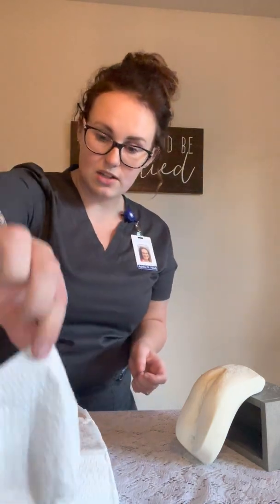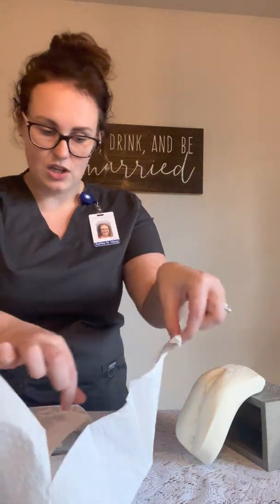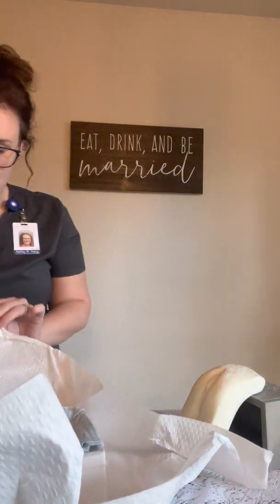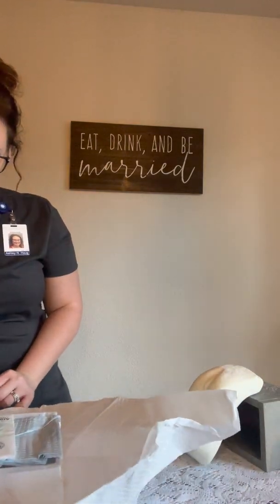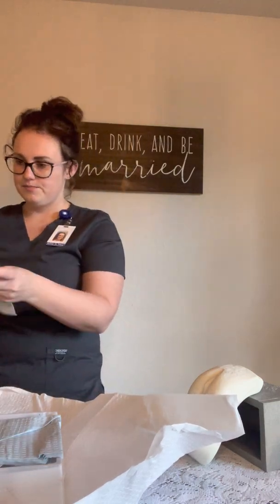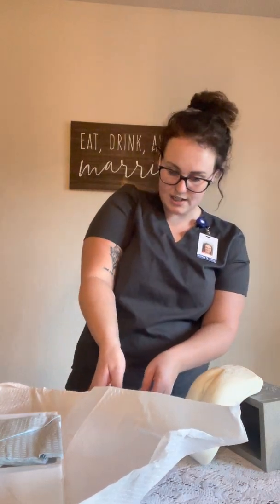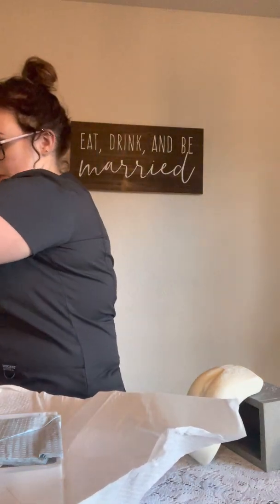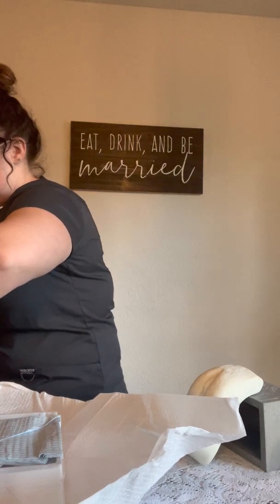So I'm going to be opening up my sterile field, just touching the corner and coming toward the patient last. Okay. So now that I have a sterile field here, I'm going to place my sterile gloves. Okay. Just touching the corners here. I'm going to actually move these over here so that I can maintain my sterile field here in the center.